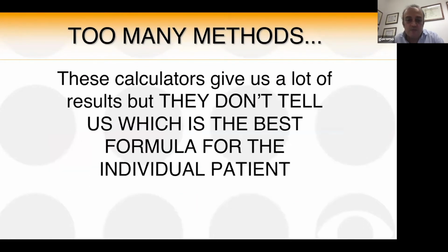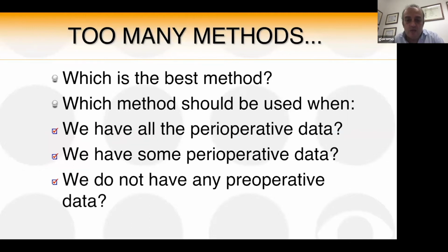So we have to think of our patient and the data we have. There are methods that should be used when all the data before and after LASIK are available, when only some of these data are available, or when we do not have anything.